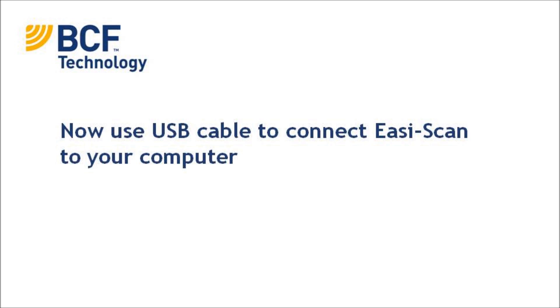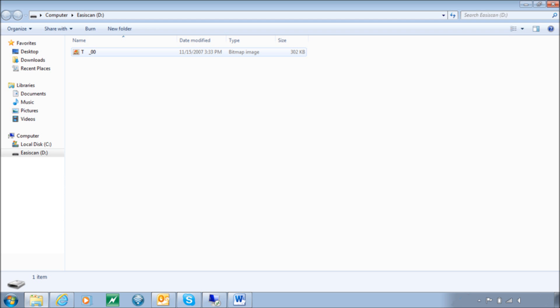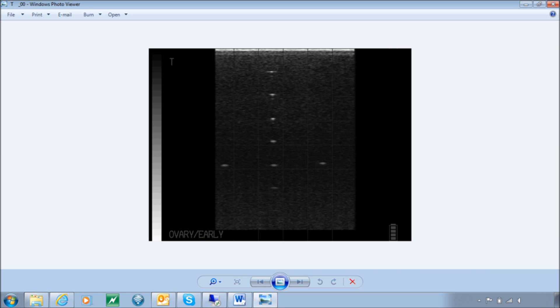Once you have changed the output setting on your Easy Scan, you can now plug in the USB cable — one end to your Easy Scan and the other end to your computer. There should be a screen that automatically pops up for autoplay. You want to select the option that says 'open folder to view files.' Once you open that folder, you'll see a list of your images. You can select each image to see it. Then you can use the save as button to save them on your computer. This functions much like a flash drive or USB drive.